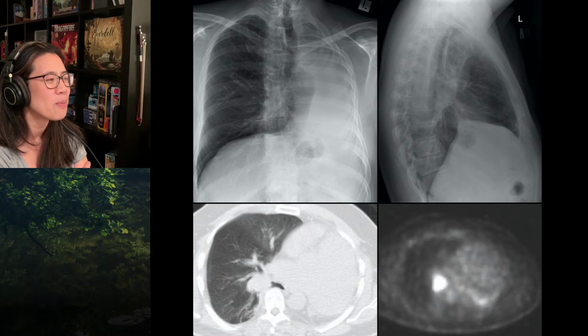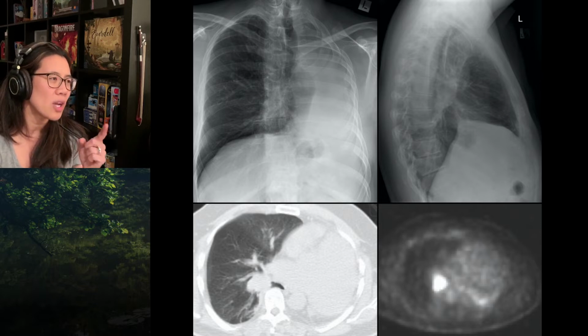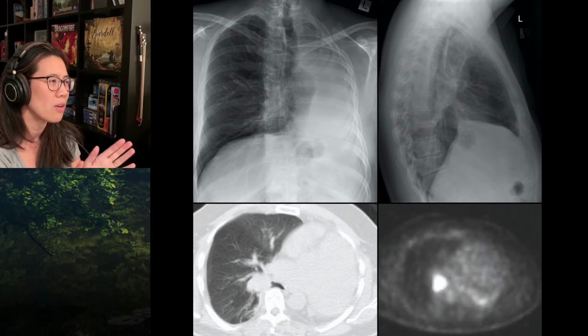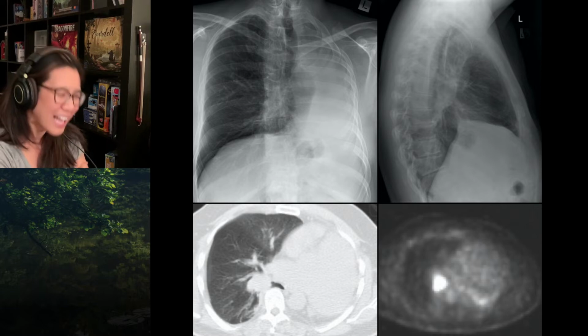Yeah, that's not fun. Did you have a previous for comparison? So was that density? I just reported this. It was pre-op cardiac thoracic, so I thought he had left hilar lung cancer, with collapse of his left lung. I didn't know he didn't have a left lung. So I just reported it as a central lesion obstructing his left main bronchus. Yeah. But as you say, those rib changes, those chest wall changes are quite chronic, aren't they? Oh, look, I got it wrong. Put me in peer review.